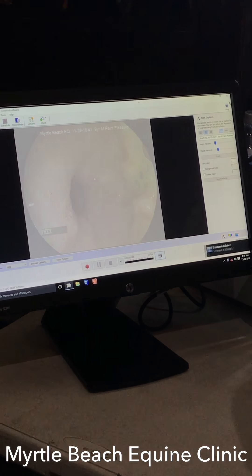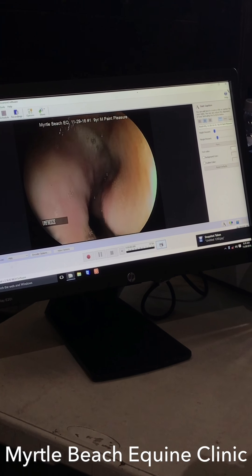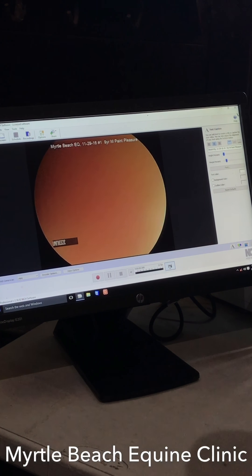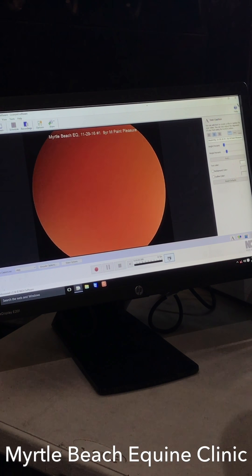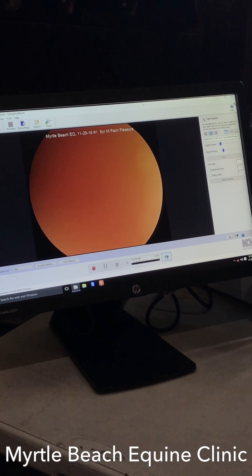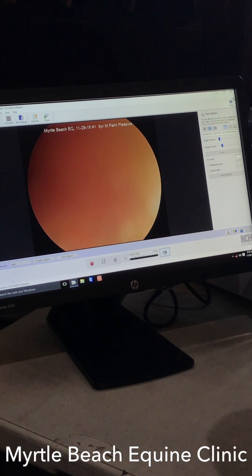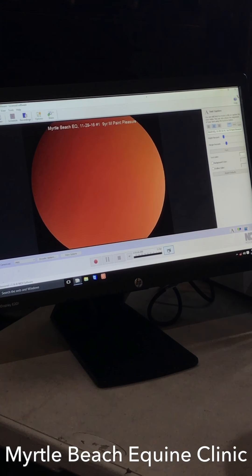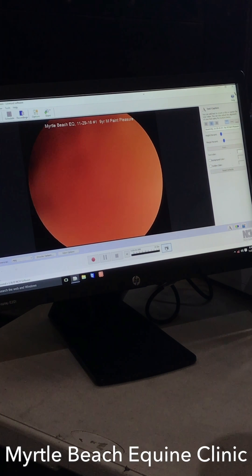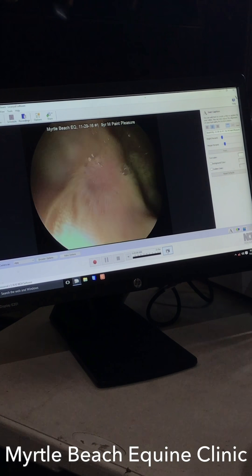A couple of good shots of pylorus there, and that looks pretty healthy. When I was with Connie in Texas not too long ago, we had a ton of horses that actually had pyloric ulcers. We're right up against the stomach wall because it's contracted on us — she's saying that we're hungry. When you're too close to the stomach wall, you just can't see anything.